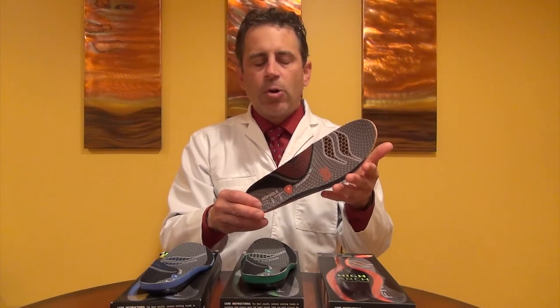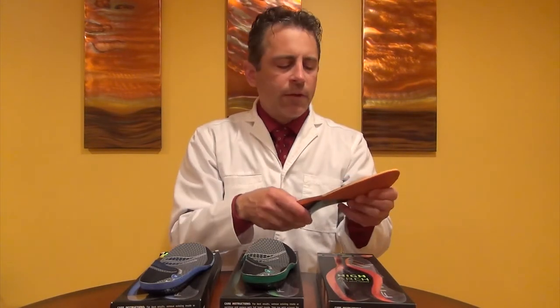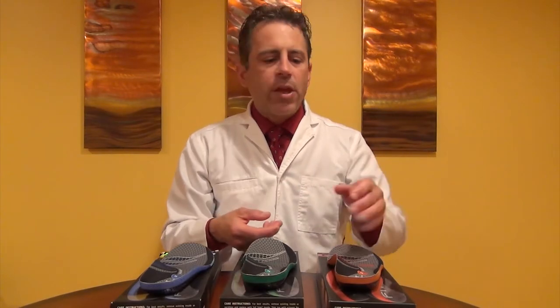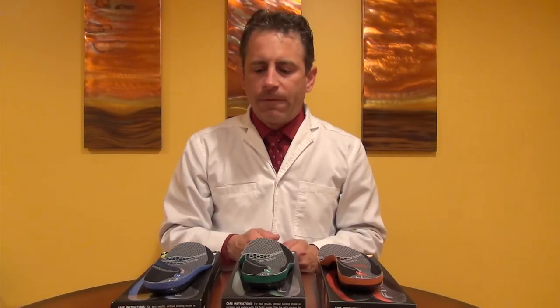All of the inserts are covered by foam. The stiffness of the foam is the same in the forefoot on all three inserts. However, in the rear foot of the arch support, the higher the insert is, the softer the foam that they use. They're all fairly close when you feel them with your thumb, but you would need a machine to actually test the durometer or hardness of the foam.